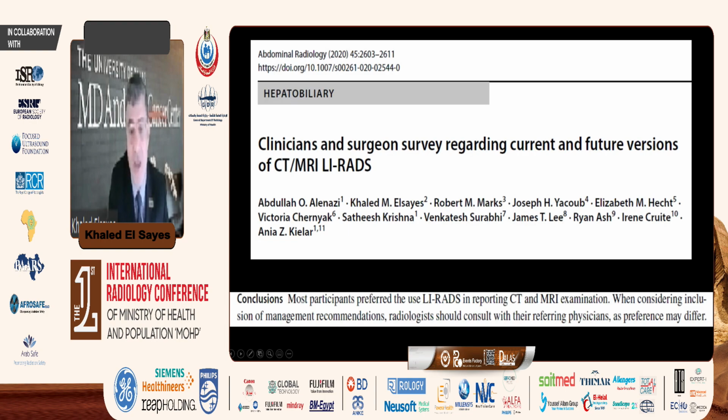We did a survey of clinicians and surgeons, asking them exactly what they prefer, and most participants prefer the use of LIRADS. This is the standardization system for liver observations in cirrhotic liver, and actually most of them prefer the use of LIRADS in reporting CT and MRI examinations.